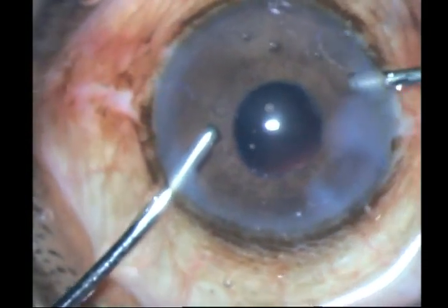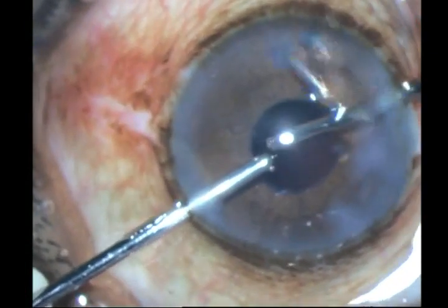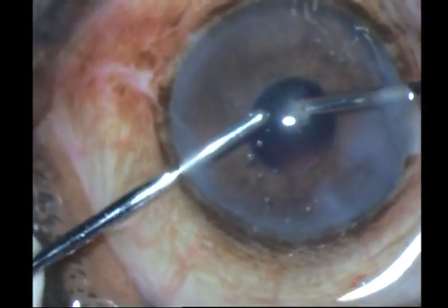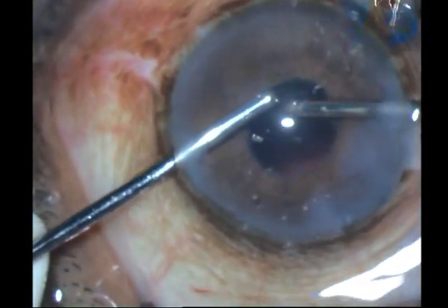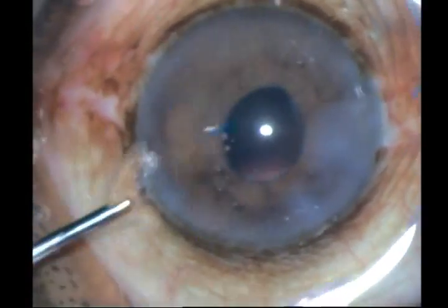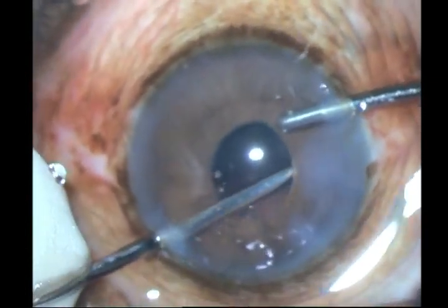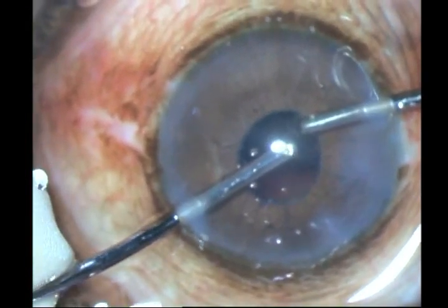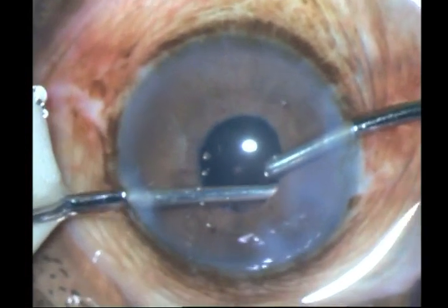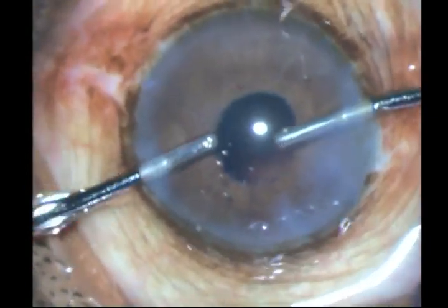Then I go with my bimanual, try to go under the capsular rim and pull out whatever cortex is there — there shouldn't be much. You may catch the pupil now and then; just make sure that you release it. Since it's a bimanual, it's very easy to change hands and get to the other side. Check all around carefully, but be careful — this is a small pupil; do not turn your port posteriorly.